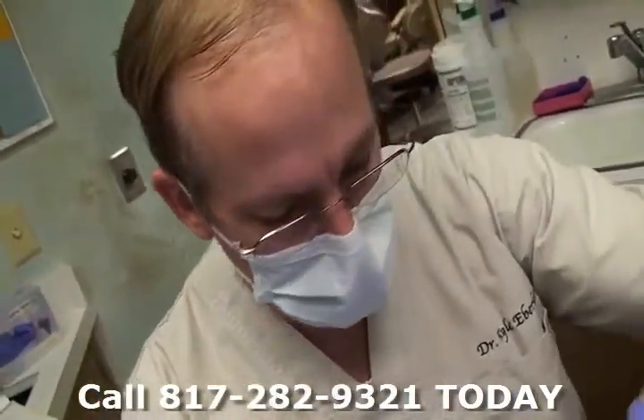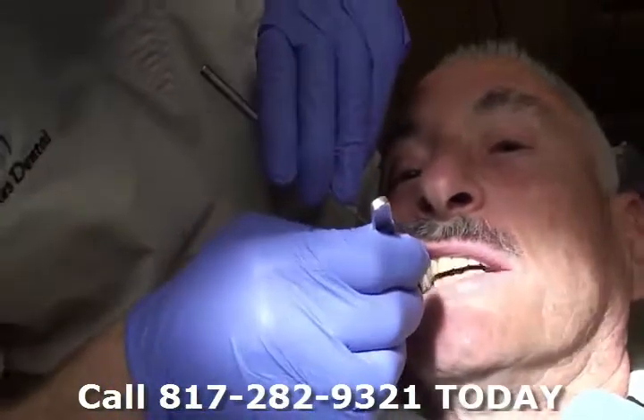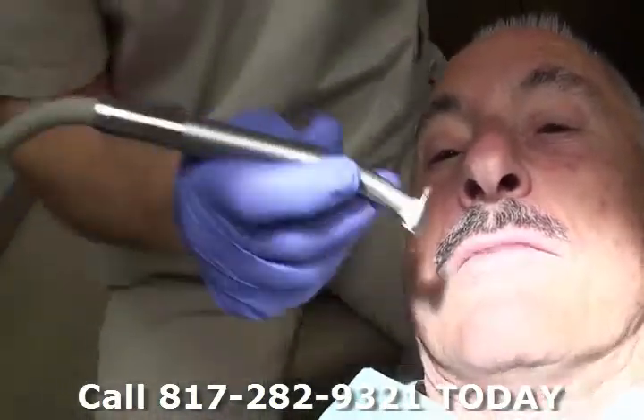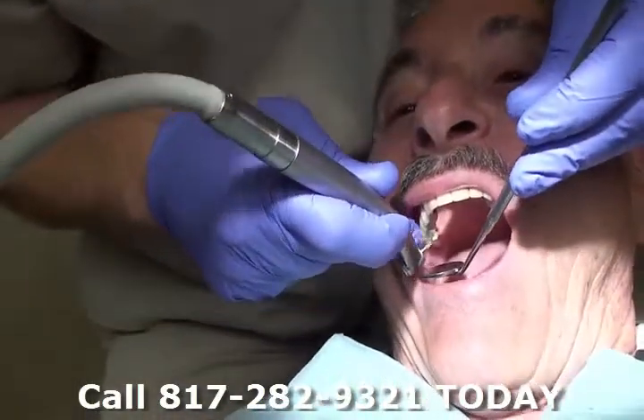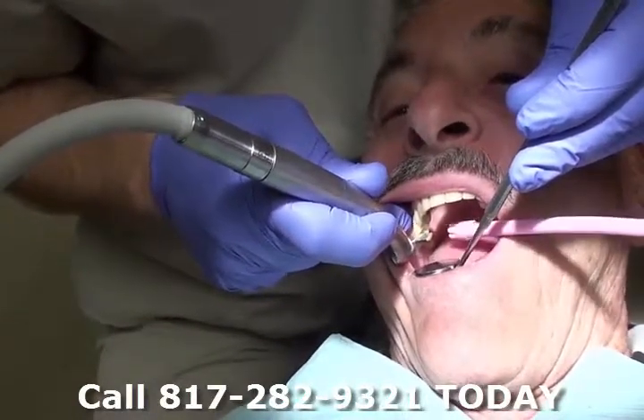Let me just do a couple little minor spots over here. Tap together. Okay, and open. Okay, so let's go. Thank you.